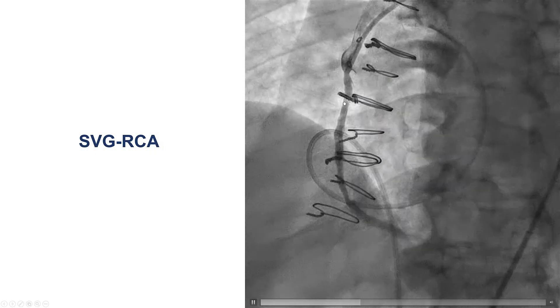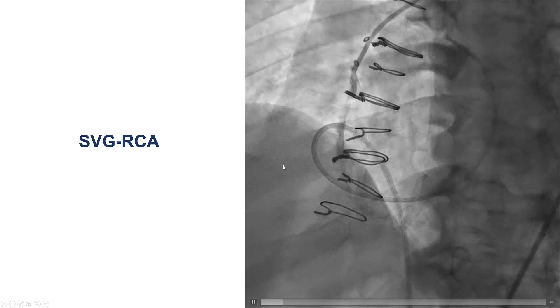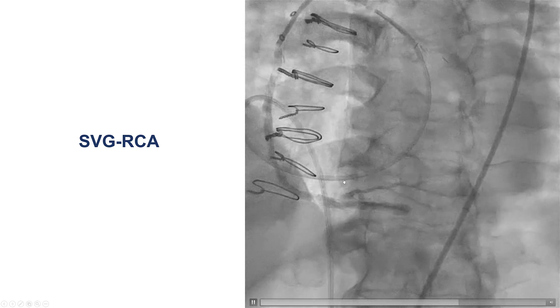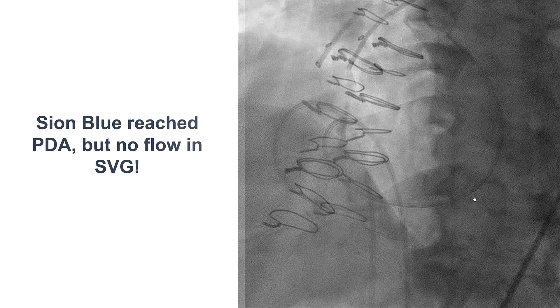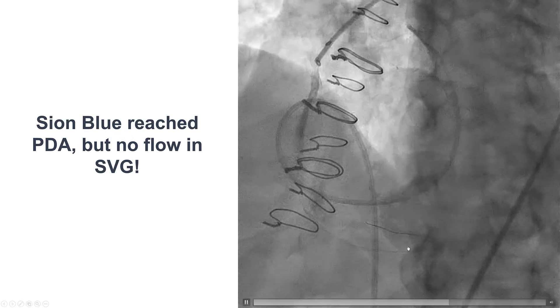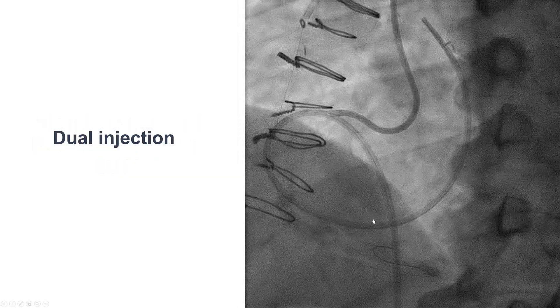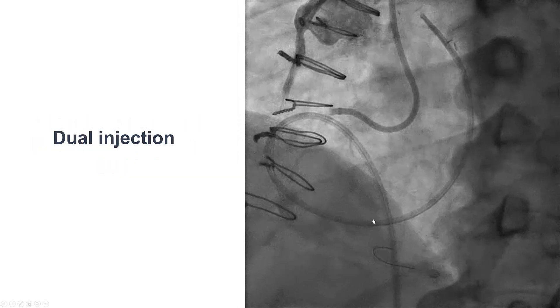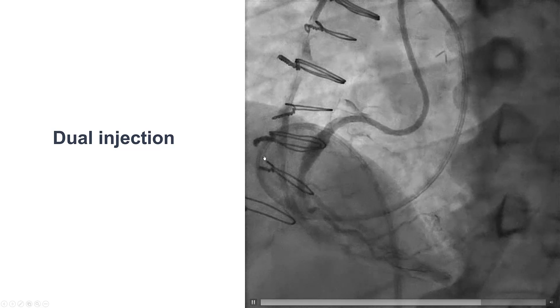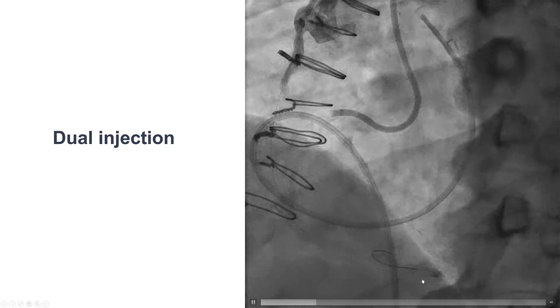This is how the saphenous vein graft looked at the day of the CTO recanalization. There was relatively slow flow, but it filled the PDA and the posterolateral vessel as well. We were able to advance a Sion Blue guide wire, but then there was a sudden sensation of flow loss as well as patient discomfort, and we can see that flow is now much worse, potentially due to embolization through this very diseased saphenous vein graft.